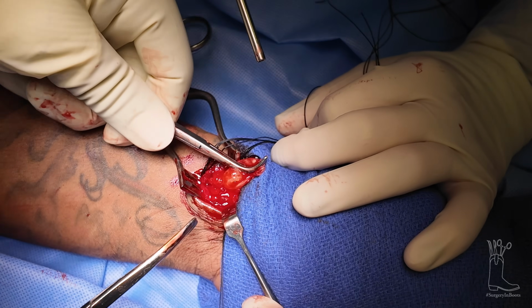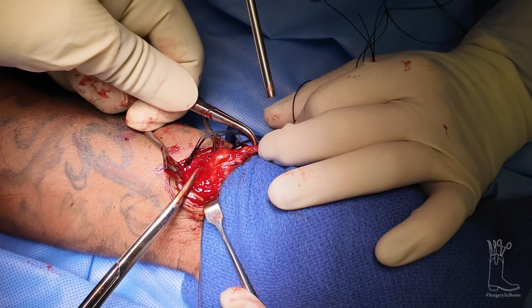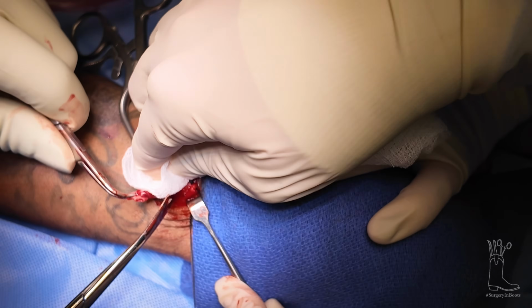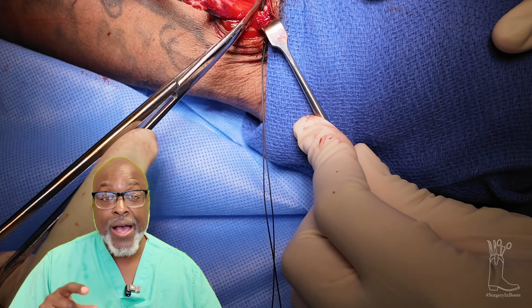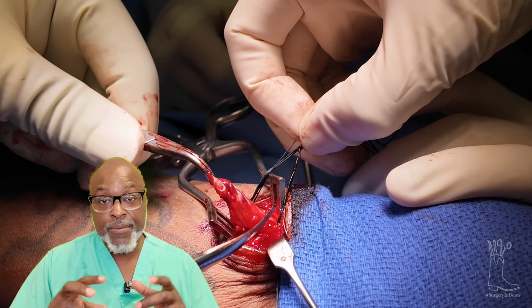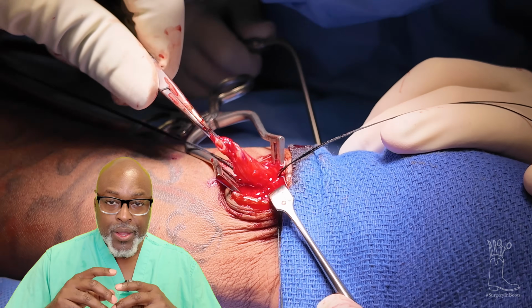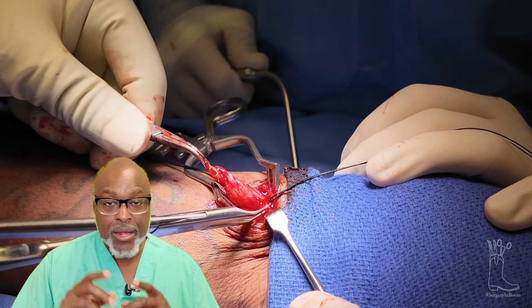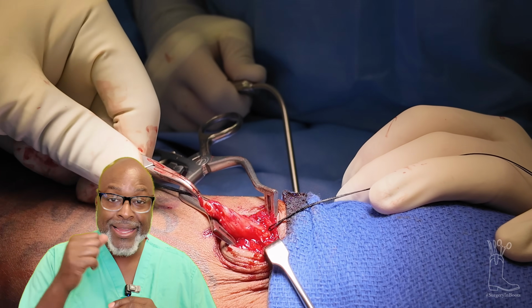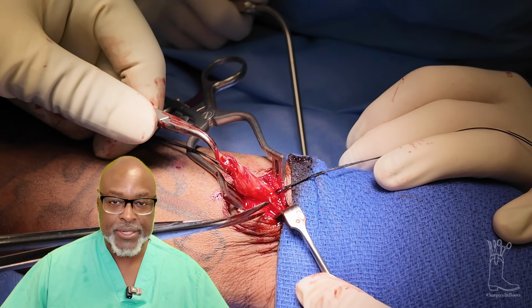Oops, and there's that's the ganglion cyst. So now you can see us taking out the ganglion cyst and the piece of it. Again, it doesn't have a true cystic wall, so you kind of have to be in between removing the fluid, scarring it down without necessarily scarring in the joint and increasing the risk of arthritis. Not so much in old people, but in young people, especially with sports injuries, you're seeing a lot more.